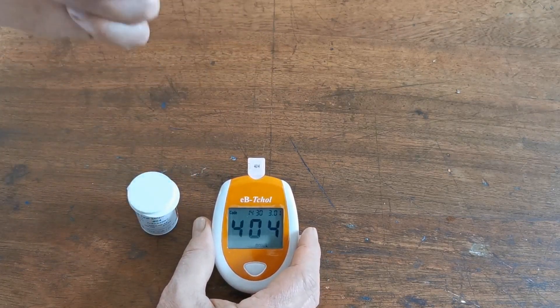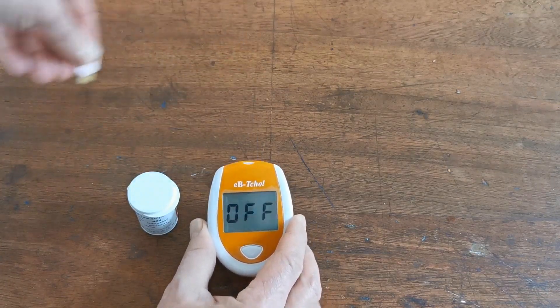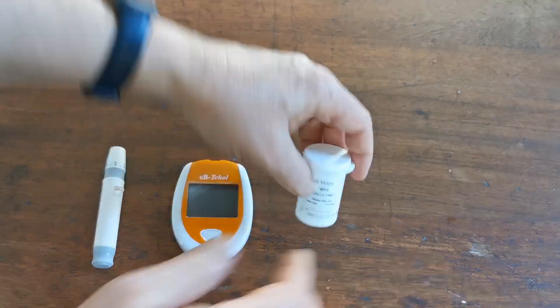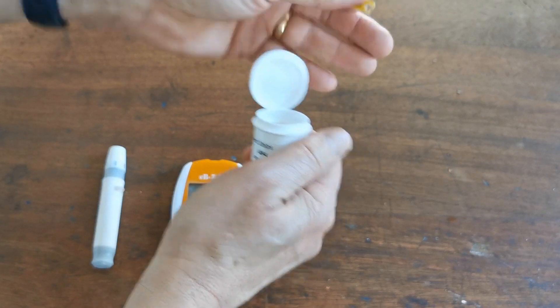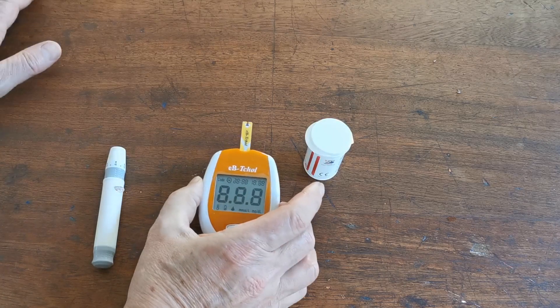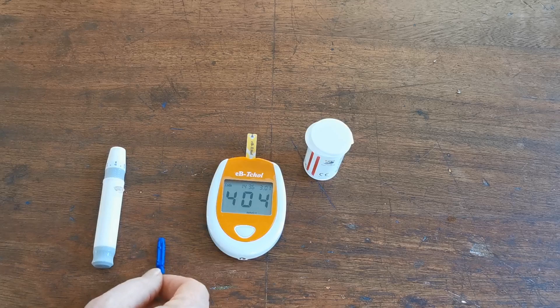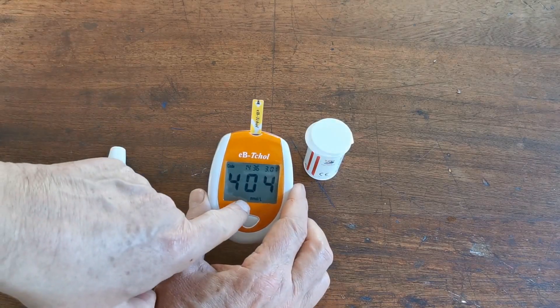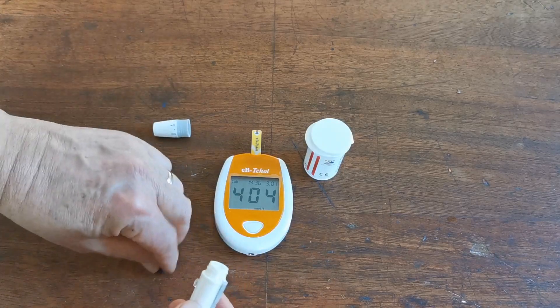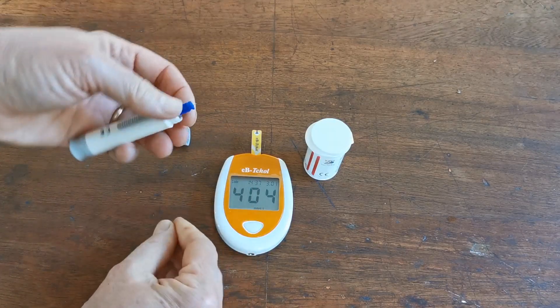That's all you have to do — the meter is now calibrated for batch 404. You'll see that number on the side of the test strips; it will vary depending on the batch. Remove the code chip and the meter will switch off. Now open the pot of test strips, remove a fresh test strip, and insert it into the top of the meter where the code chip was inserted. While doing that, prepare the lancing device — you'll see 404 with a blood drop flashing, indicating the meter is ready for a blood sample.